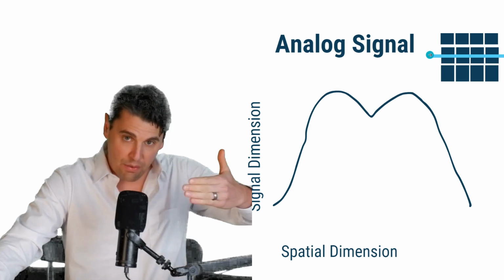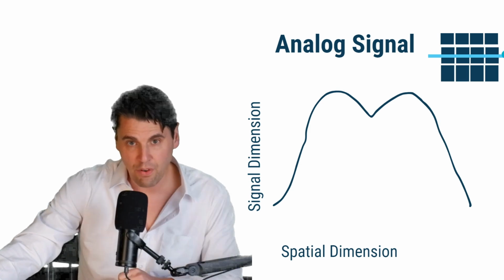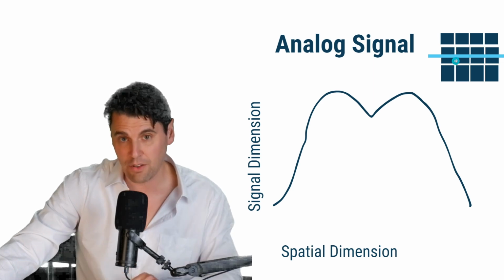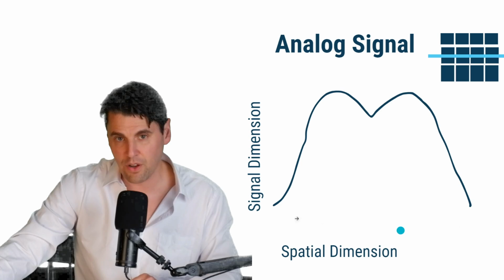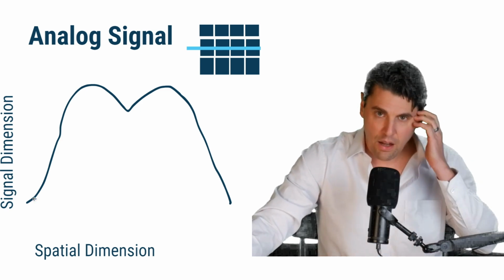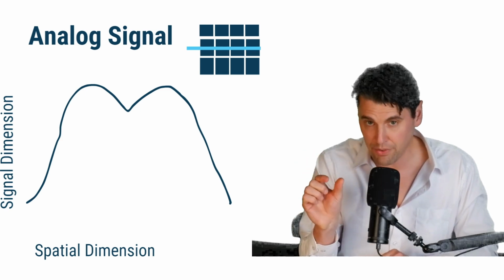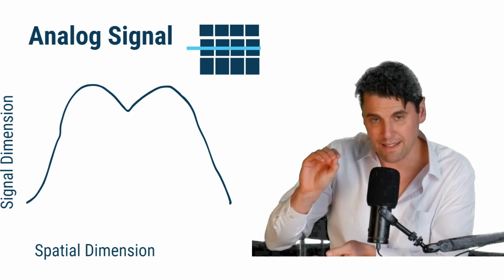Imagine the X-rays come through the patient. They're interacting at the detector plane, and if I draw a line of what the analog signal should be at the detector plane, imagine the analog signal should look like this. And this is just kind of a made-up signal, but this is a function of the distance here on this axis, and then here is the actual signal. So we can get an idea of a couple factors here, both the effect of the spatial sampling and then the effect of the sampling of the signal, or the quantization of the signal.